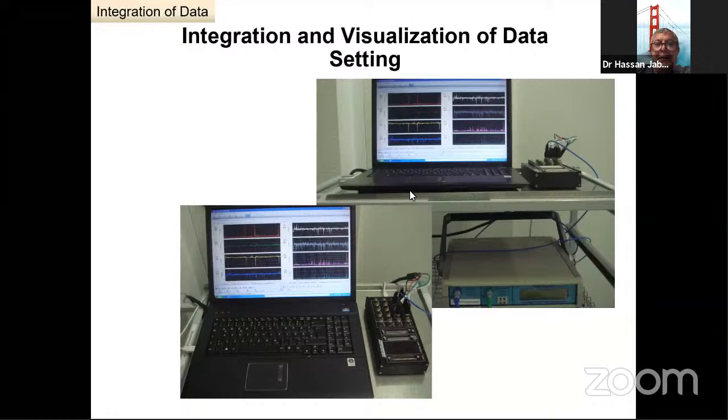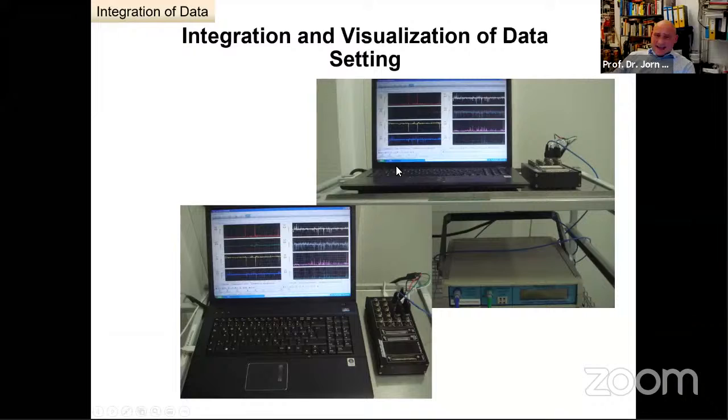Okay. So you can actually see that this is my monitoring system. We use a standard laptop. There's a software being developed by the guys in Cambridge, which is basically an integrator of all the measurements, and you have an AD switcher here where you put the analog data in and change it into a digital system, and you can visualize it here, and then you can do those things like ORX, PRX that I was talking about before, and go into depth with this. It is quite difficult to set up at first, but once it's done, it's stable and easy to use.